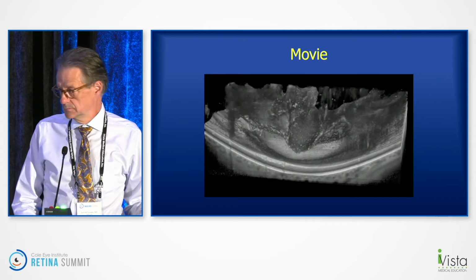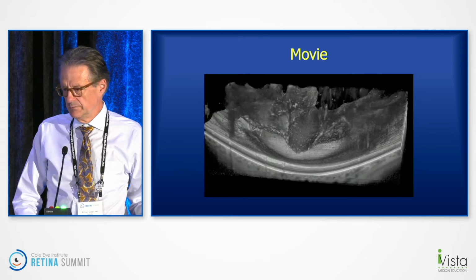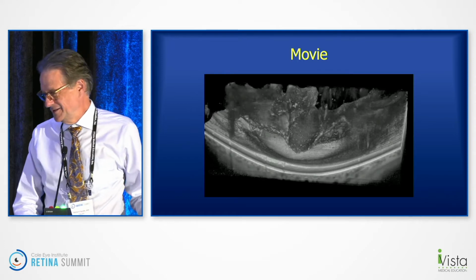That's a symptomatic floater, no doubt about it, right? This is actually just somebody in their mid-30s. So where do you apply the laser? Yeah. Right, yeah. I do 1,000 YAGs.